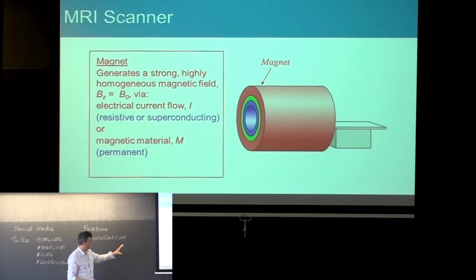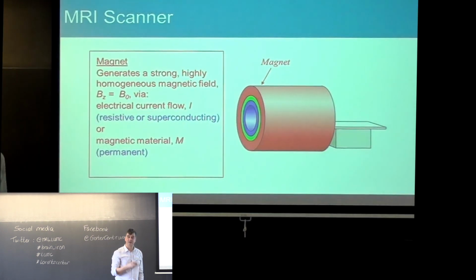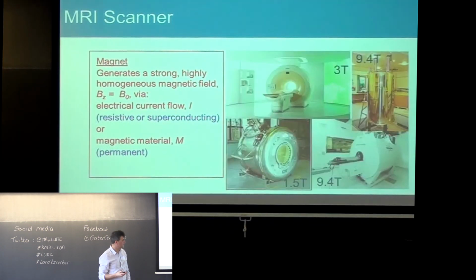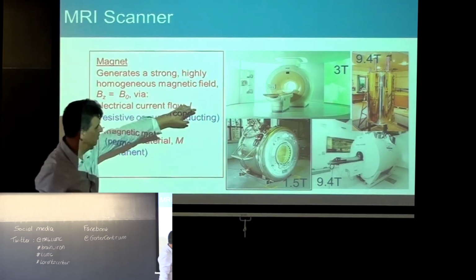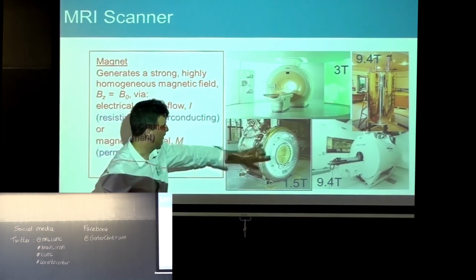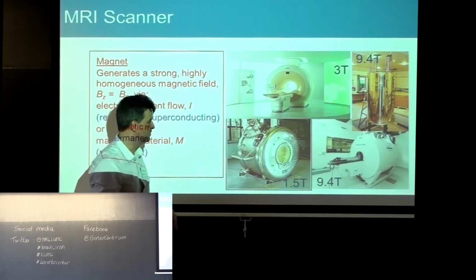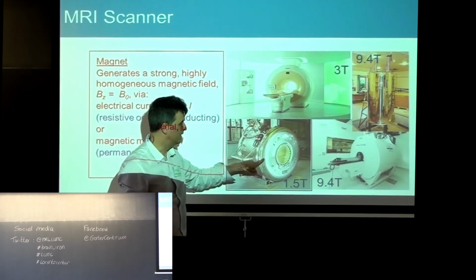I'll very quickly mention just what goes into an MR scanner. Essentially, you can view a common system as a set of concentric coils. You have big coils to make the magnetic field. They're usually superconducting coils, and so they carry the current forever and ever, and they make a very strong, stable magnetic field. These are typical commercial systems, and then if you take off the covers, you see what's underneath. Basically a vacuum flask containing liquid helium, keeping the windings cool.